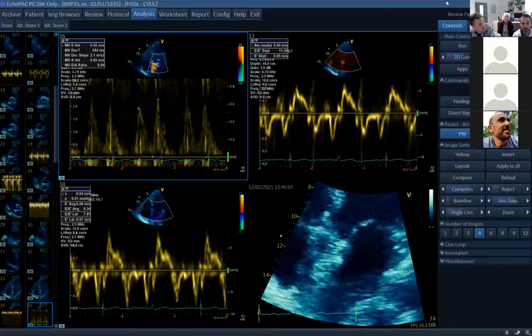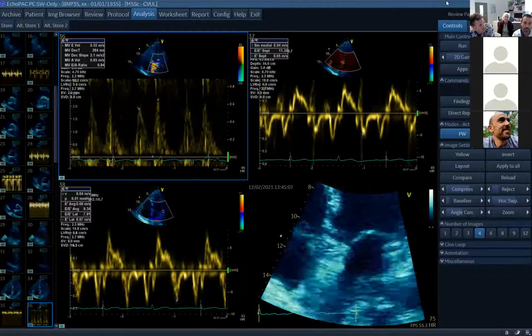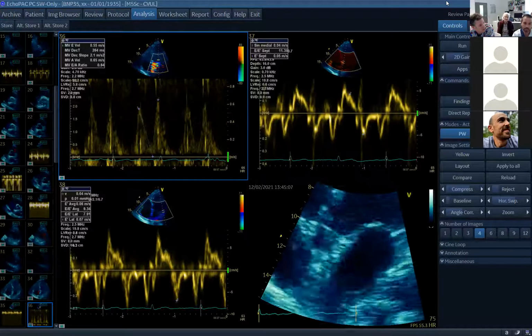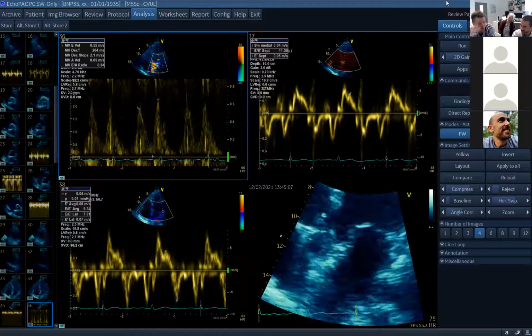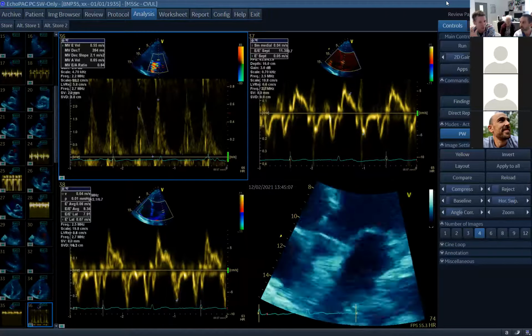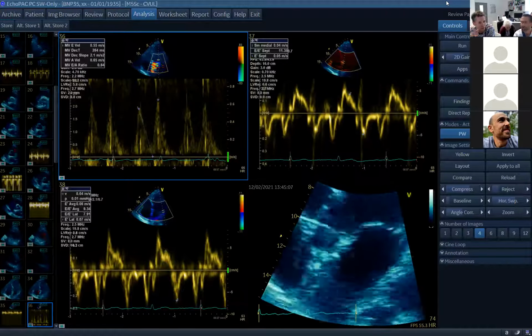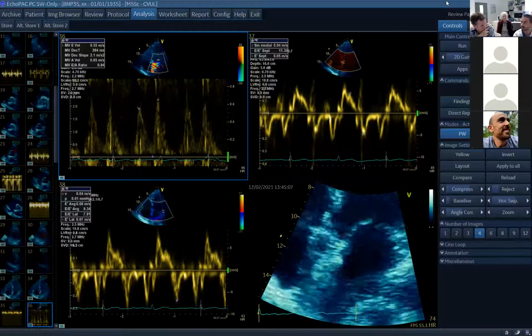And in the setting of an impaired LV function, and inotropes, I have to go down the algorithm. So you're going to be in that second table if that's what we decide to go with. And again, there's arguments not, but it's the best we got. If those two parameters are normal, that's either going to be normal or grade 1.